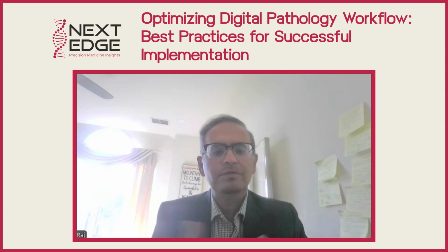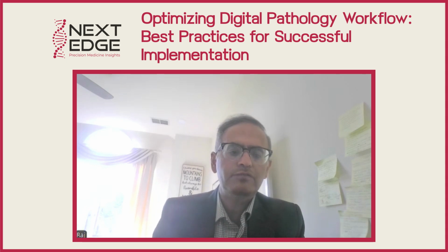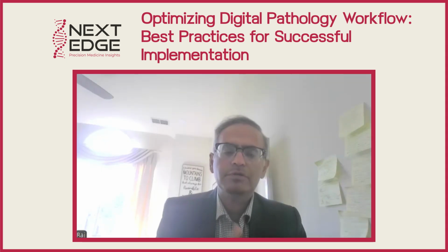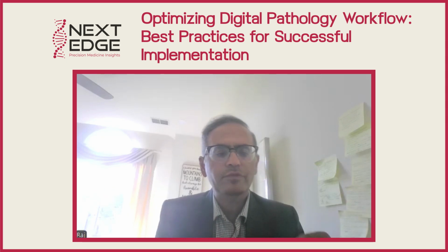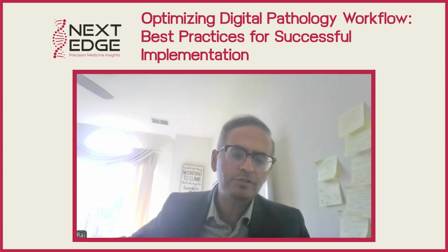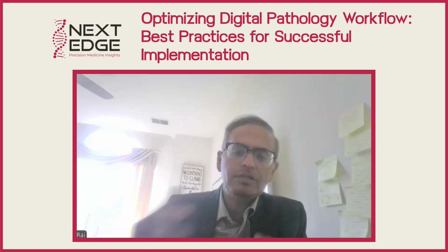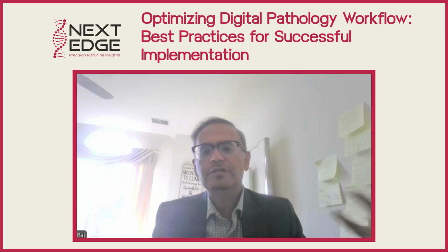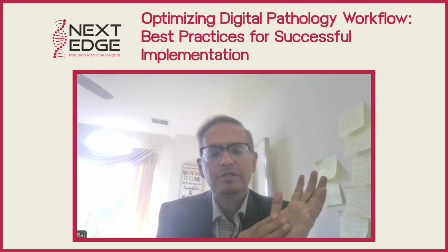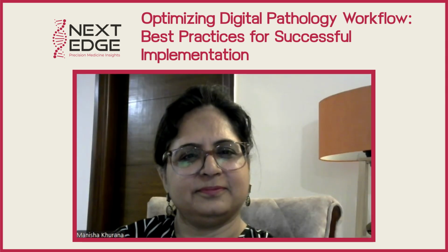I know what the diagnosis is, I know what I want to tell that clinician, but sometimes when I try to transmit this information in a report, I'm not the best person to do it, because of lack of experience or lack of English language skills. But now these tools can help me produce a report as if it is coming out of Harvard or Johns Hopkins, because I can talk about the features to the generative AI system, and it will take all that information and put it in a way that is very comprehensible. So you can start using these tools to your advantage right now.